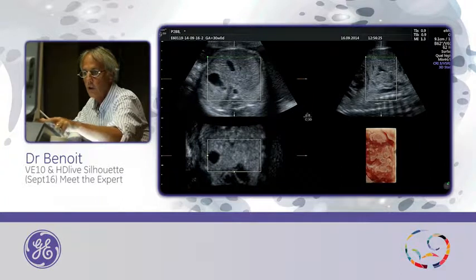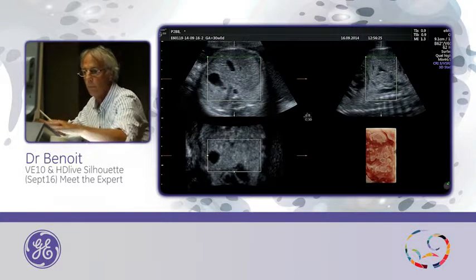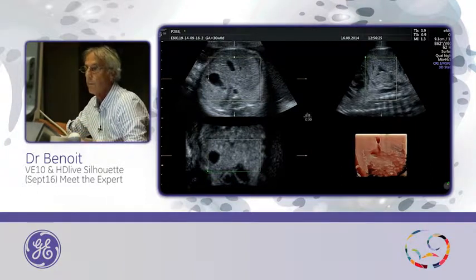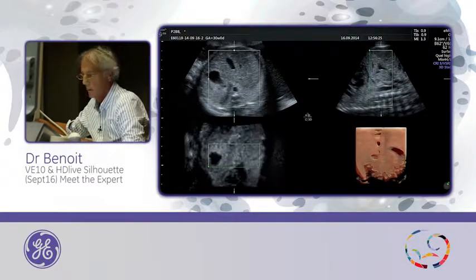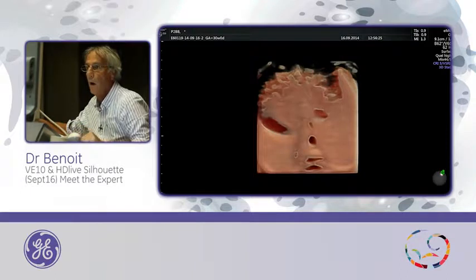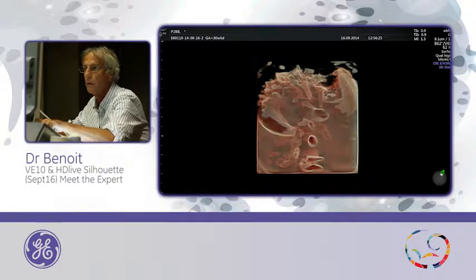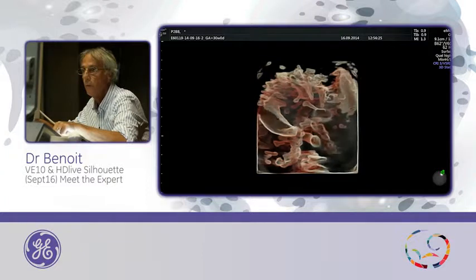So the baby was moving. I need the multiplanar view to know where I am. I will change the position of the box. So sub-render. Okay. Reduce the size of the box on the B plane. Okay. Okay, and now increase the silhouette.